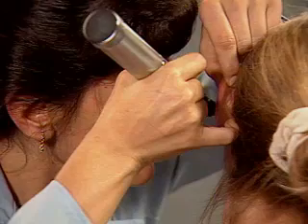Note any cerumen or ear wax that may impair your view. Also observe for any discharge, foreign bodies, redness, swelling, or scaling. There should be none.